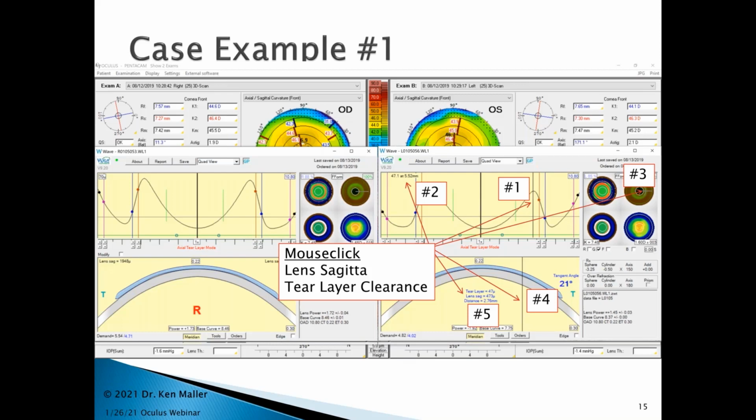Number 3, you can see the fluorescein screen, and there's a gray bar that's going to the right on the radar screen there, and that's because that's the actual spot that you are on this lens that you're checking. That radar can spin around, and you can then check this around the entire lens. Number 4, it puts the gray vertical line there as well to show you exactly where you are between the lens and the cornea, and you can see you're right through the reverse curve. You can actually see a little space there where the reverse curve is lifting up off of the corneal surface.